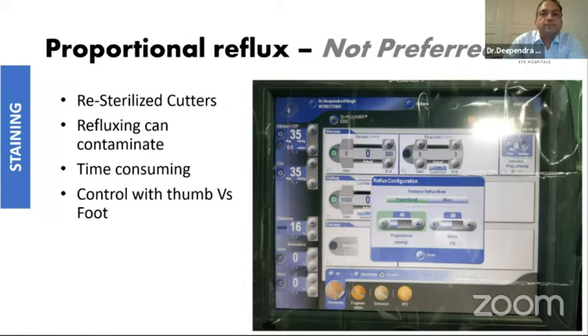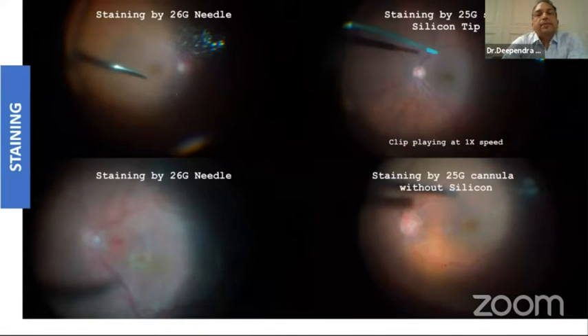Many colleagues sometimes use proportional reflux for staining, but we don't prefer it. The main reason is that many times, because we are reusing our cutters, reflux can actually contaminate the system and the whole process becomes more time consuming. Also, you have to control the dye injection with your foot rather than your thumb. Our thumb-to-brain time is lesser than our foot-to-brain time, so that's why we don't advocate proportional reflux for staining.